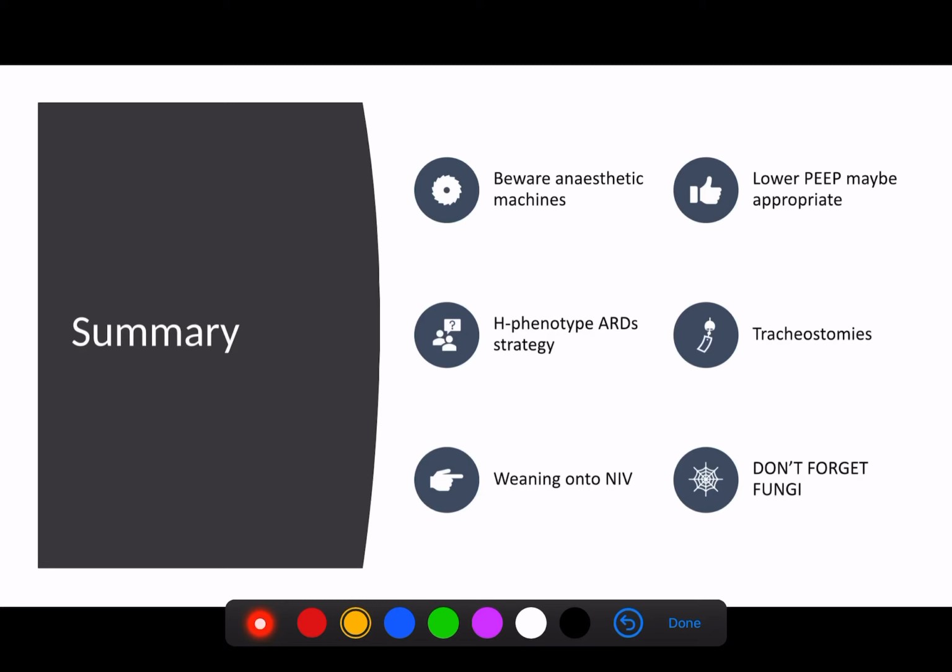So just by way of summary, I think it's really important to be aware of the anaesthetic machines and their limitations. Please go and have a look at my video on that. Lower PEEPs may be appropriate for patients. I think actually it's going to be debatable, and personally I think reducing the amount of atelectrauma is important, and so APRV, even if it's on a low setting, is, in my personal opinion, just as good, if not better, but certainly the advocates here are for lower PEEP strategies.